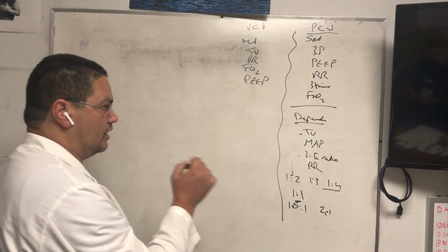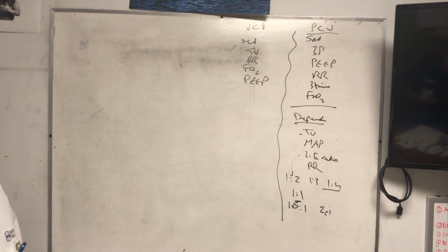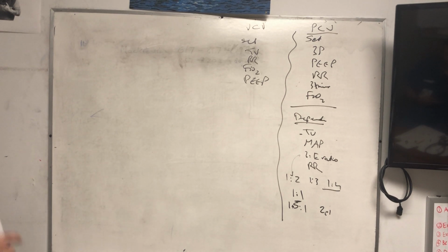But if you're switching for hypoxia, you're switching for the I time, so you have to tell the I time. Sometimes if I want to be quick, or when I trust the respiratory therapist to do whatever they want, I just say, give me a 1-to-1 I to E ratio and do the rest. That's more important than anything in cases of hypoxia, right? And then what else is a myth of pressure control?